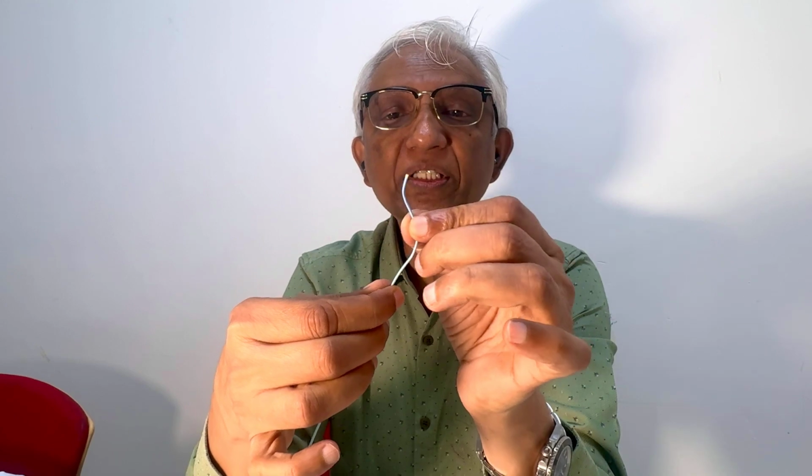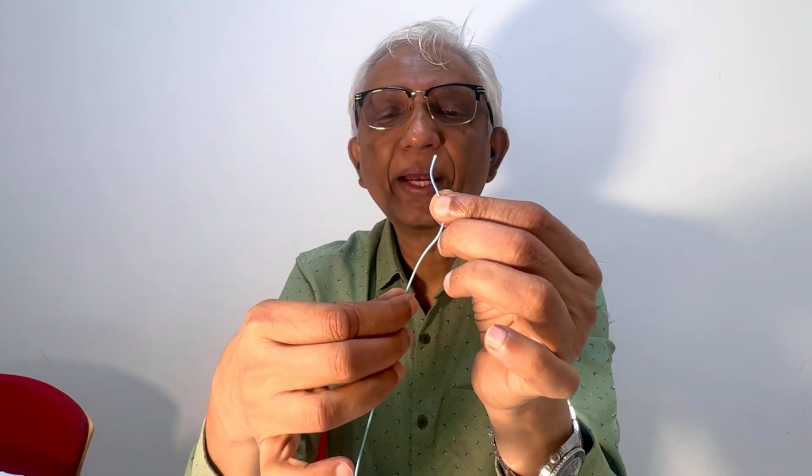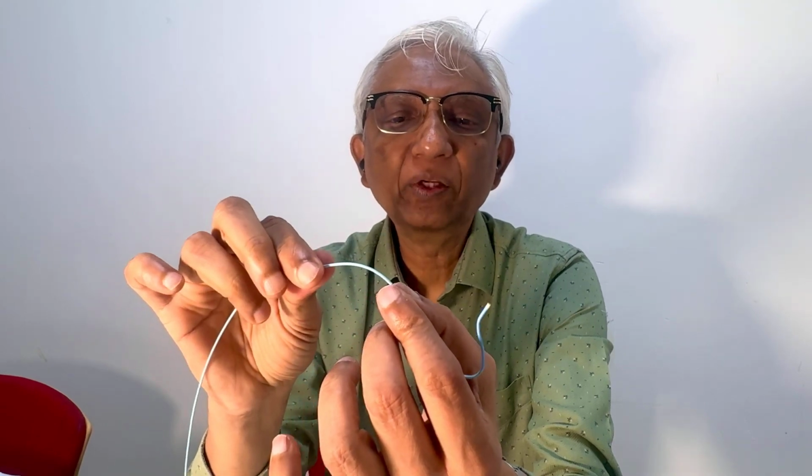So imagine what happens in real life. When you enter the body, this catheter will look straight, right? You have to first of all make the curve. So where do you make the curve? One of the places, you just push the catheter. If it by some chance enters a renal artery or any artery and you push it up, it forms a curve. Otherwise, typically, just go into the arch of the aorta, and when you come into the ascending aorta, it will automatically form a curve against the valve, and then you bring it out.